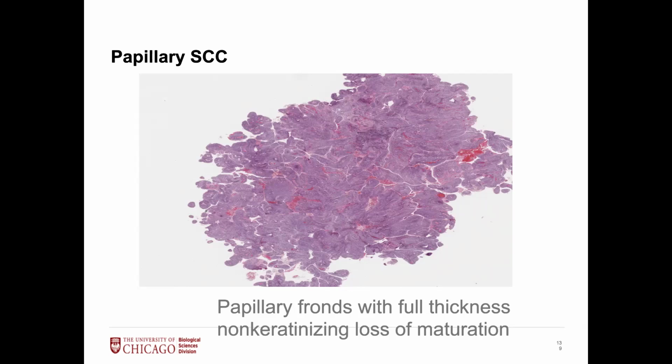This is a tough call. This is a tough call on frozen. This is a tough call on a permanent section, but we've kind of accepted that they're so exophytic, so bulky, that how can the surgeon really get under there and get to the bottom of it and get to the stroma to give you that invasive component.